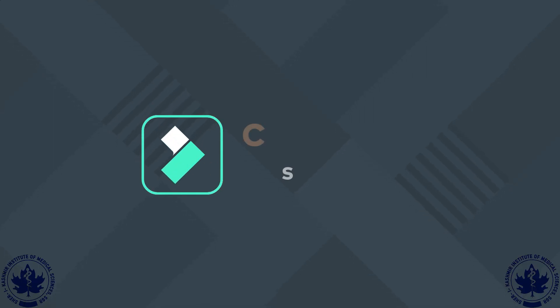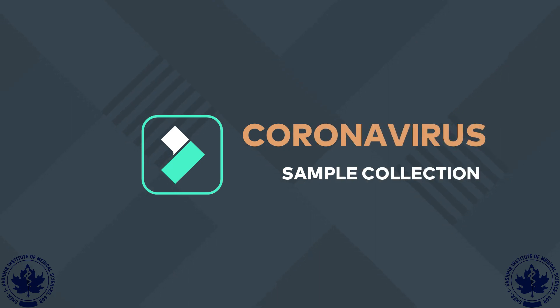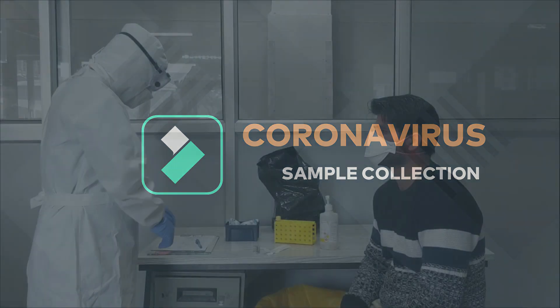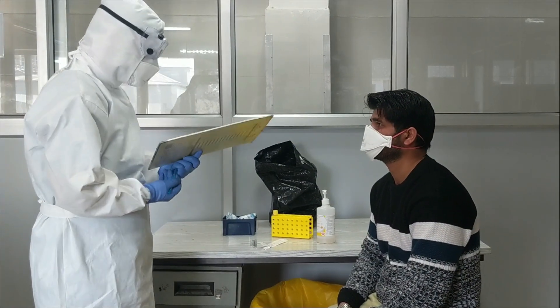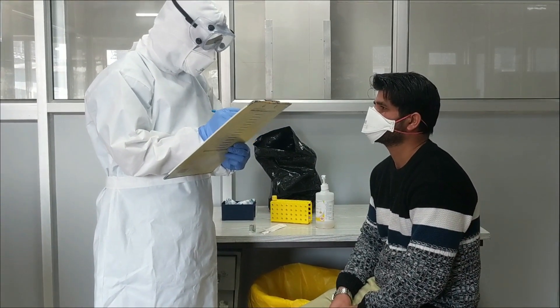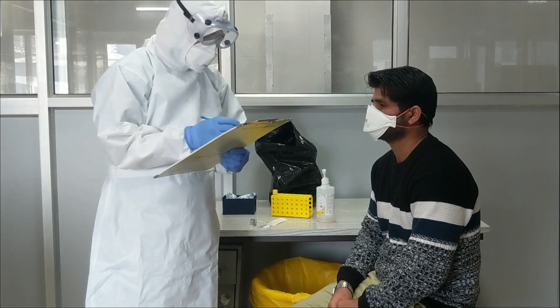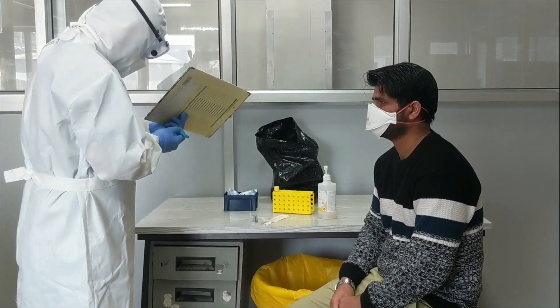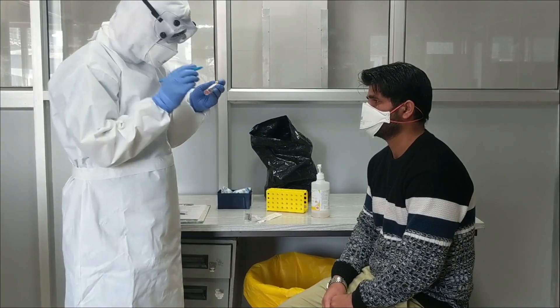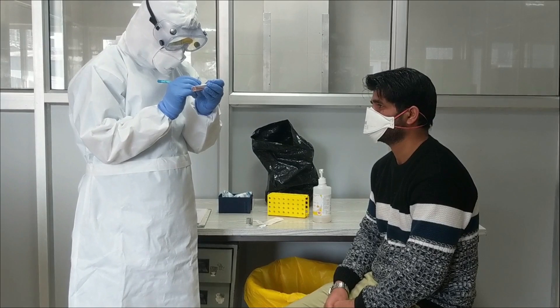We are going to demonstrate how to take nasopharyngeal and throat swabs from a patient suspected of any viral infection. Specimen collection should be performed by healthcare personnel who have completed training and demonstrated competency. Always use PPE before sample collection. Collect the necessary medical history and label the sample collection tube.